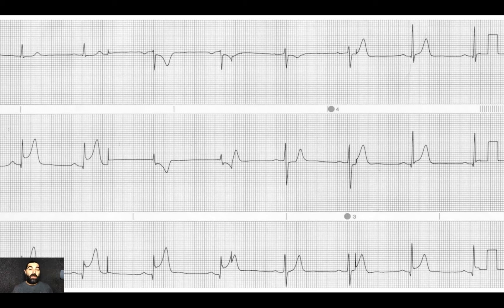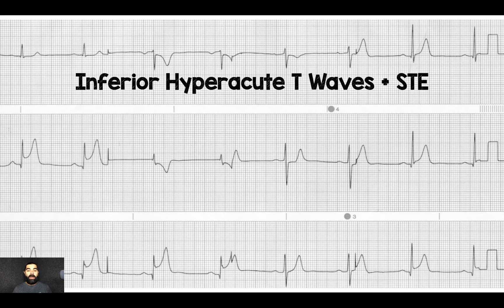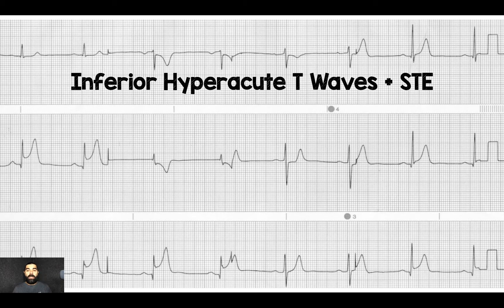Here's another example — a 56-year-old female coming in with crushing chest pain. If you look at the inferior leads II, III, and AVF, you can see not only ST elevations but also hyperacute T waves. Those T waves are broad-based, they're tall, they're taller than the QRS, and the QRS definitely fits inside that T wave.